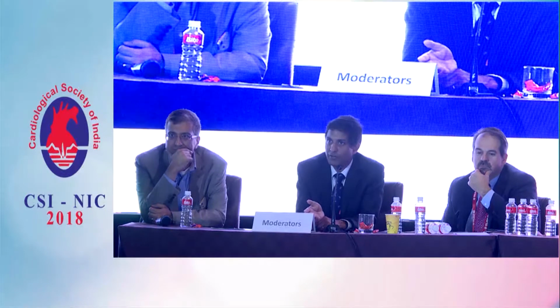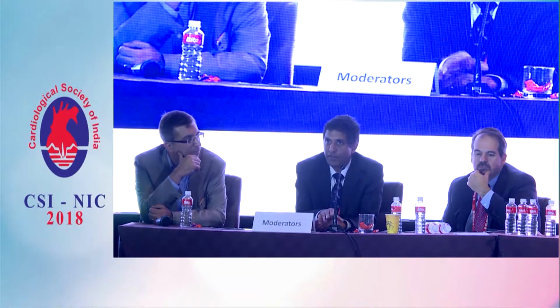Thanks for your attention. We're still using ipsilateral. We keep a wire all the time on the ipsilateral side just below the large sheath. We put an 018 wire. And as you know, with TAVR becoming very routine, obviously we are taking on smaller femoral arterial sizes, and so we do end up in a problem at times. And it's as a safety wire that we keep it on the ipsilateral side.